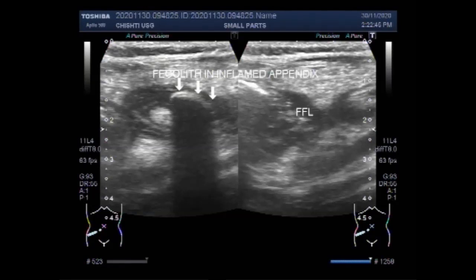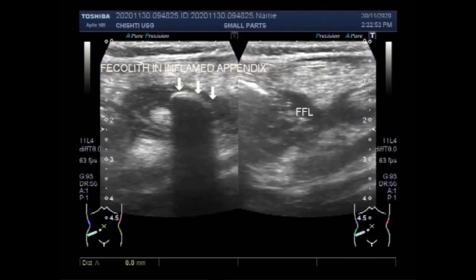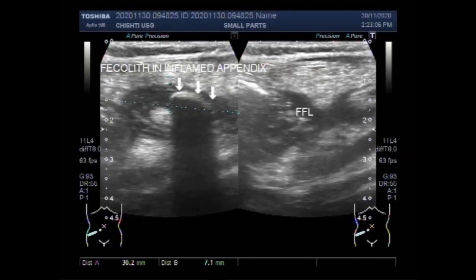Ultrasound should be the first imaging modality for diagnosing acute appendicitis. A primary ultrasound diagnosis will decrease ionizing radiation and cost. However, the sensitivity of ultrasound to diagnose acute appendicitis is lower than CT or MRI.